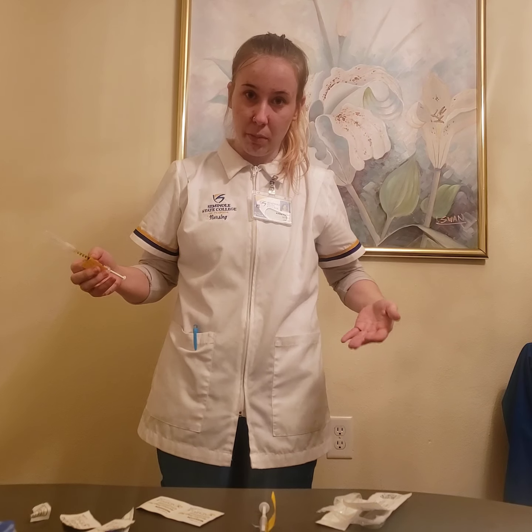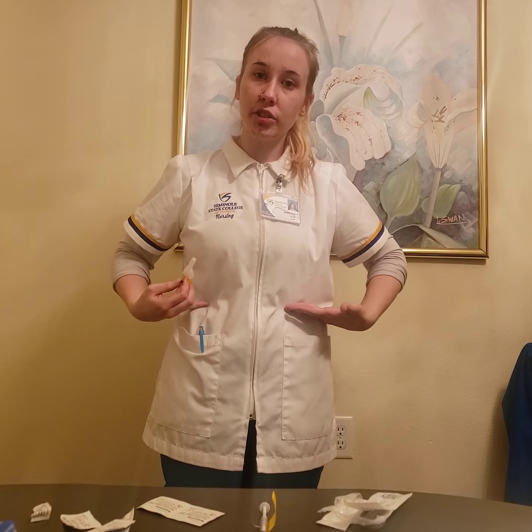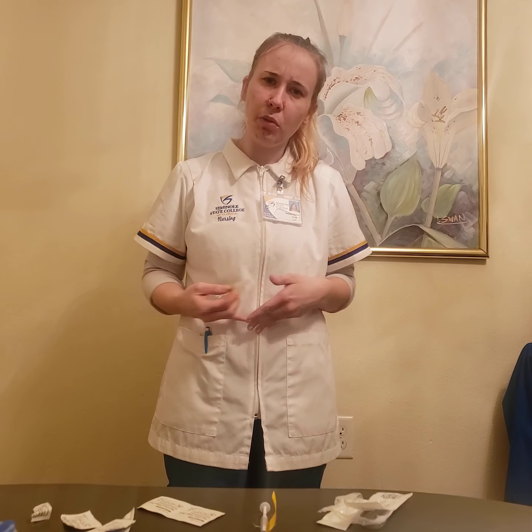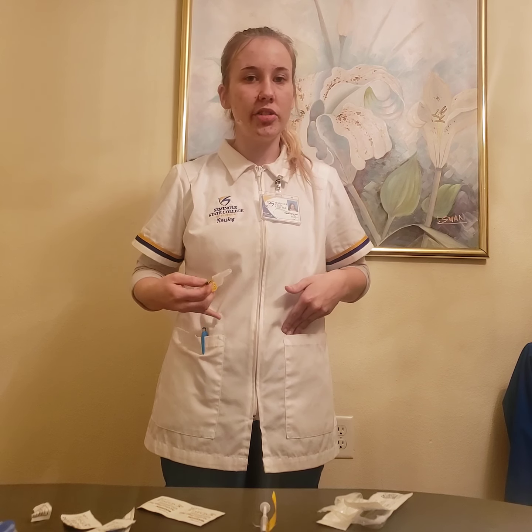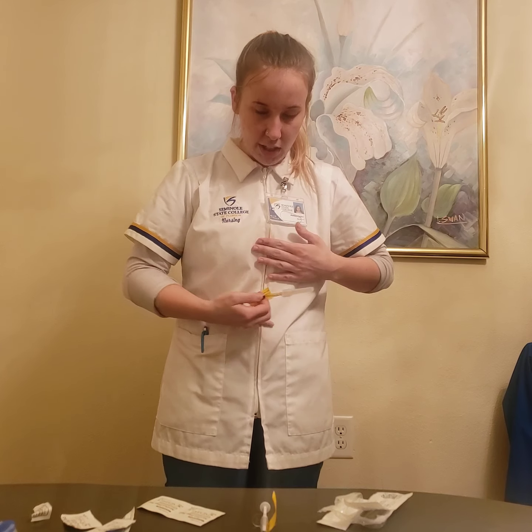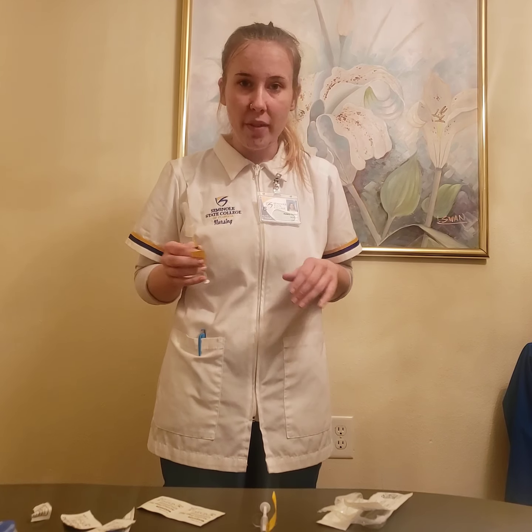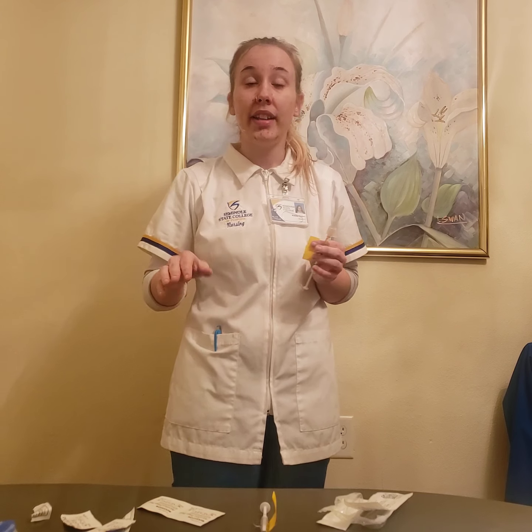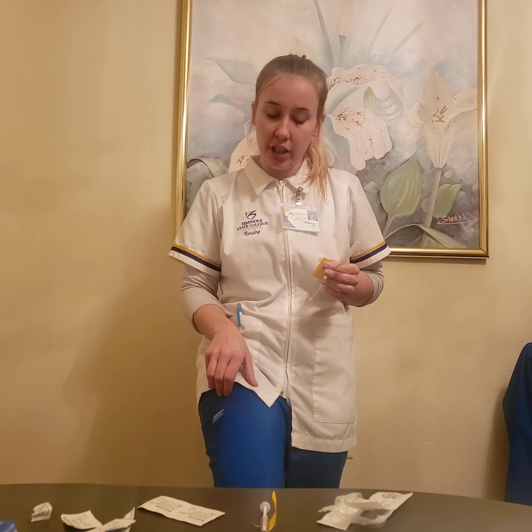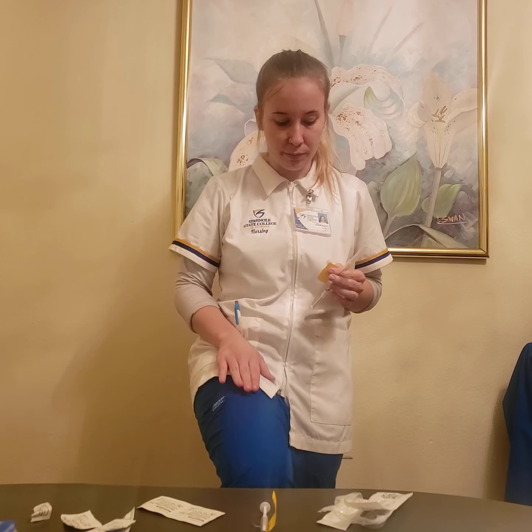or into the abdomen, anywhere below the costal margin to above the iliac crest, and you want to avoid the 2 inches to either side of the umbilicus. So anywhere in this plane is going to be your injection area. And the last one is going to be your anterior aspect of the thigh. You do have subcutaneous tissue here that we can use to do your sub-Q injection.